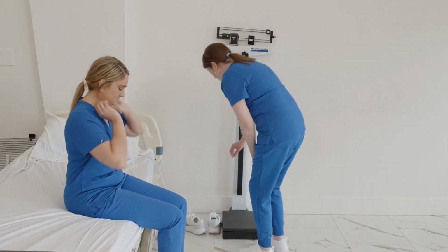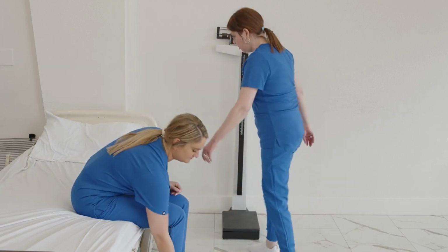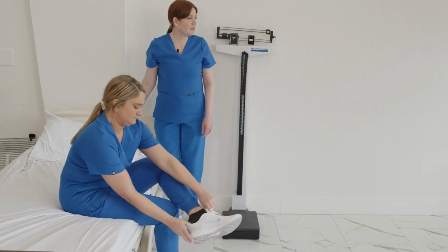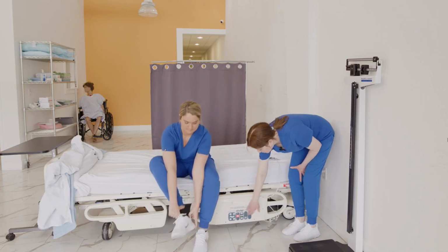Perfect. Here are your non-skid shoes to put on. And while you're putting on your shoes, I'm going to double check that it's safe to stand her up. So the bed is locked and we're in the lowest position.